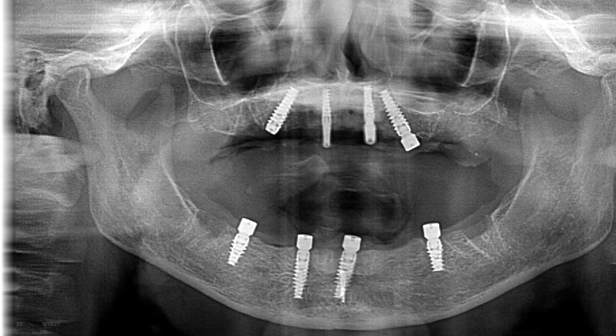I normally have them go see the restoring doctor 24 hours later just to adjust the occlusion. I will adjust the occlusion myself, but I'm not the best at it. I just play around with the articulating paper and the burr and do things by eye. But again, they come see you afterwards to make sure they're happy, give you any grievances, and you perfect the occlusion. They see me a week later, a month later, then 4 months. I usually check these implants, make sure they're all nice and tight, and then we get you back to the next step, which is the actual final prosthesis.